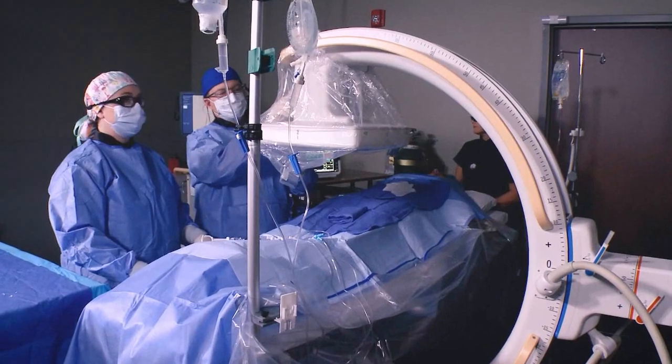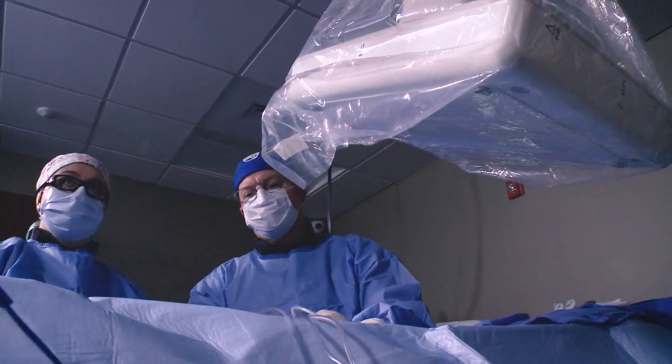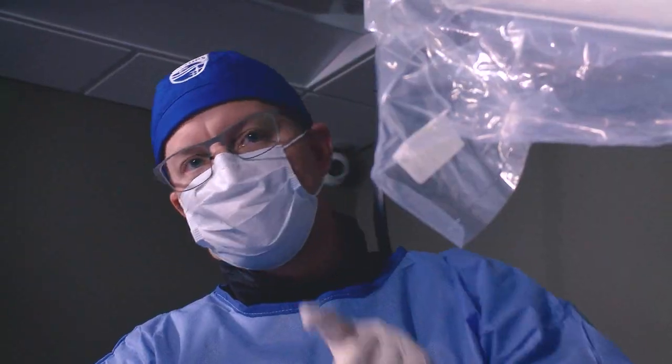Through a partnership with Philips, we were able to develop the lab here and deliver care equivalent or superior to what we could provide at the hospital, on a much more timely basis — allowing me to be more efficient and allowing patients to have a better experience.